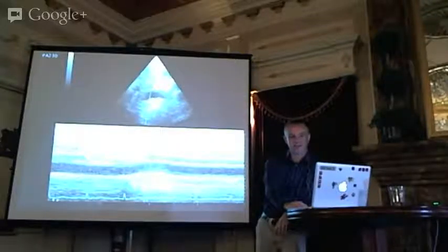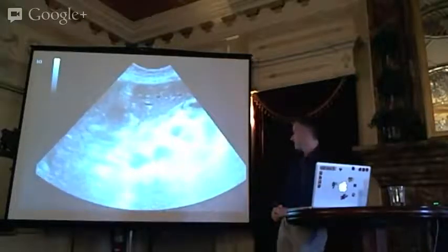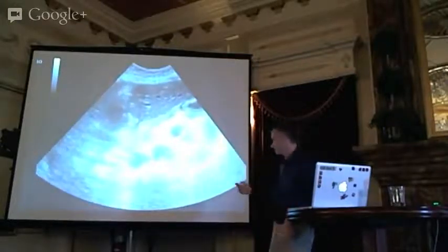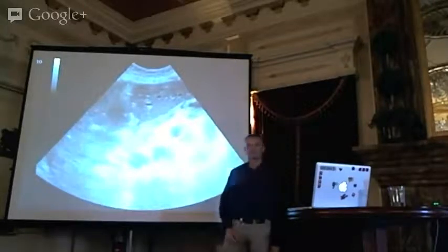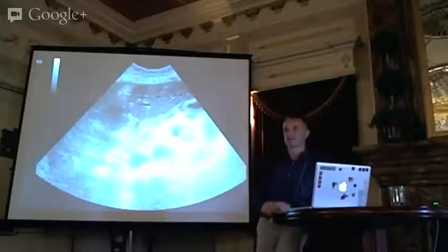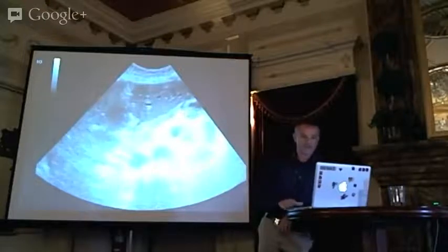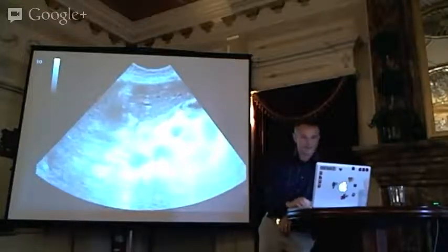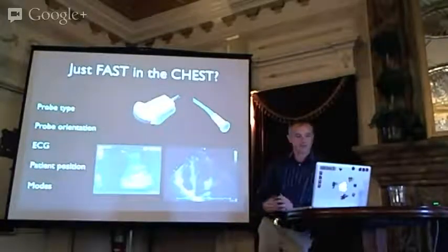I went back and reviewed the abdominal aorta images, and this one here on the right shows a dissection. In sonography, we can diagnose type A dissection with tamponade. It's completely fitting with that history, and he was treated and did well. That was quite satisfying.